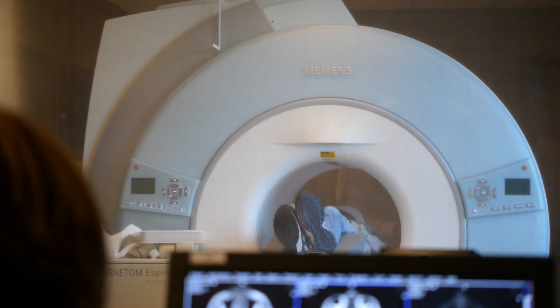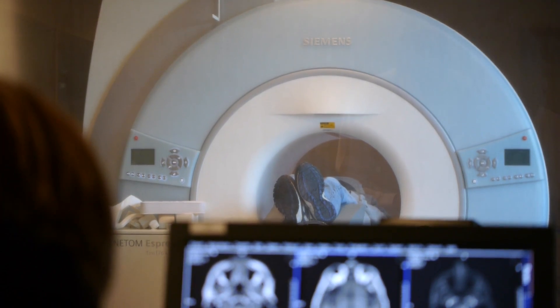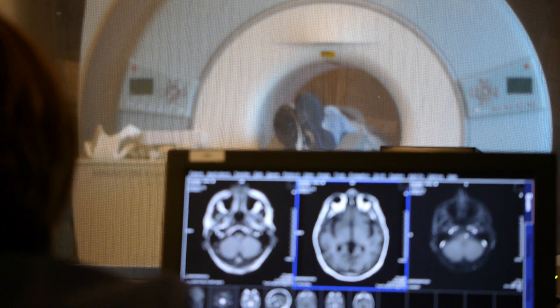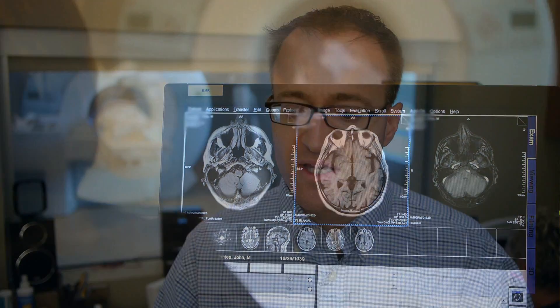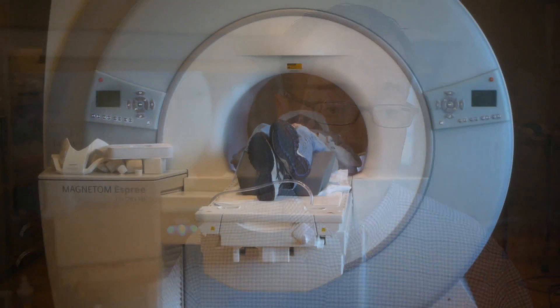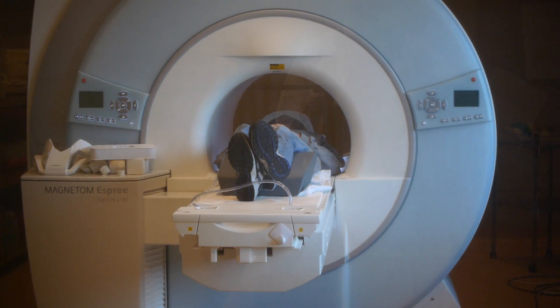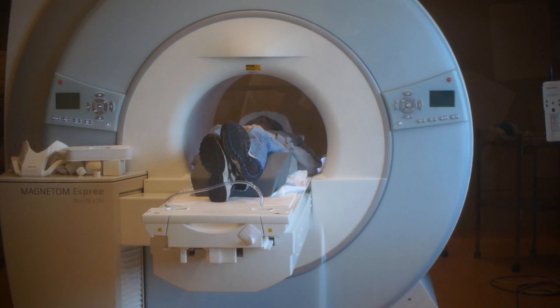This is a state of the art 1.5 Tesla MRI scanner. The opening is about the size of what a CT scanner is, and it's about as deep. So our incidence of claustrophobia is a lot less. Most patients say they can have a CT scan but worry that an MRI is a long, small bore. But when patients get into our room, they see that the window is quite bright, there's a lot of light in the room, and that the bore itself is a lot larger.